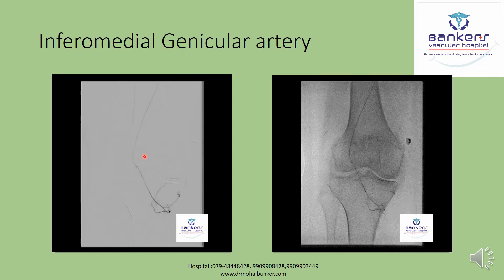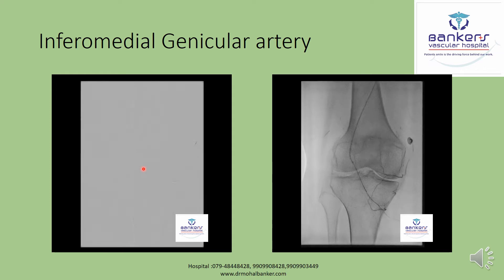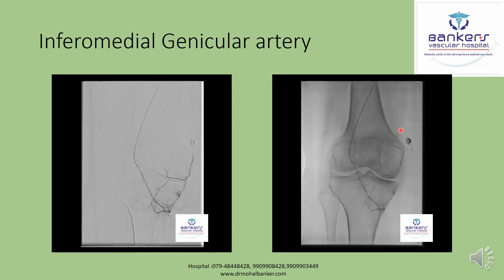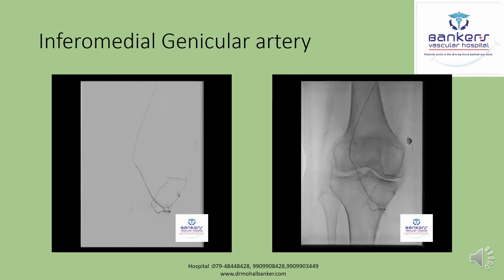The second genicular artery I assessed is the inferomedial genicular artery, which is typically a J-shaped artery. It supplies the lower part of the knee joint medially, but its blood supply does not reach the pain-producing site. Therefore, the inferomedial genicular artery is not the culprit artery producing cytokines at the site of pain.